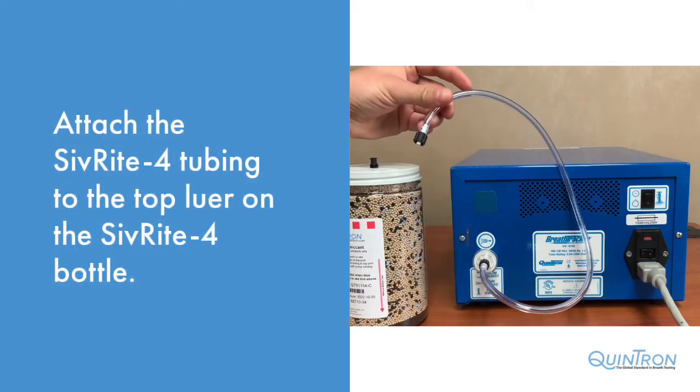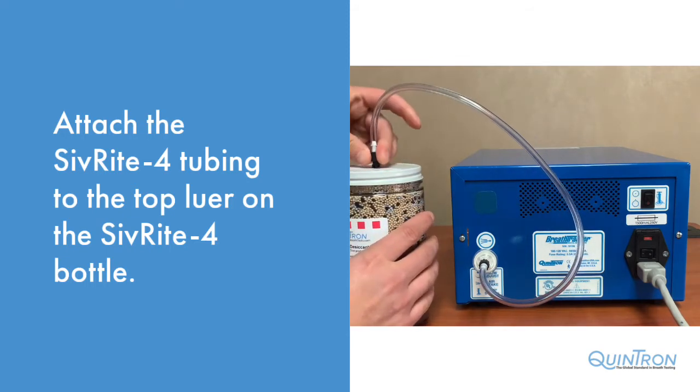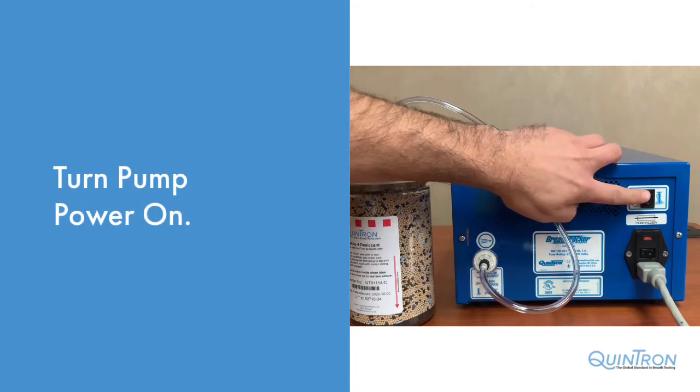Reattach the Sivrite 4 tubing to the top of the new Sivrite 4 bottle. Turn the pump power switch to the on position.